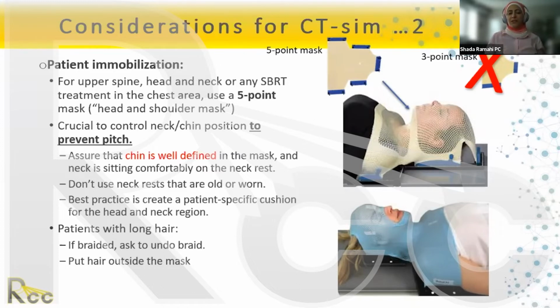So what he suggested is that when we're doing the mask, to have a sort of a pen and do a dimple where we create part of the mask that goes inside the mouth and the patient bites on it. And we leave it until it solidifies.